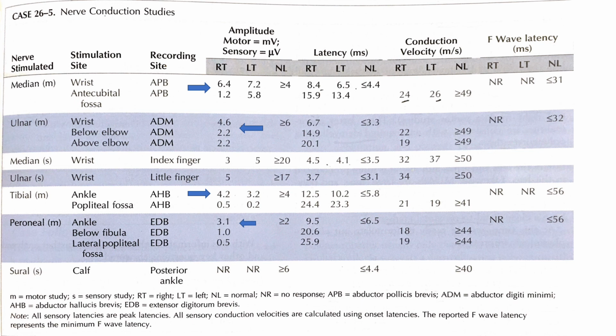Dr. Singhal will go to the next example. Can you give an example of hereditary demyelinating neuropathy?